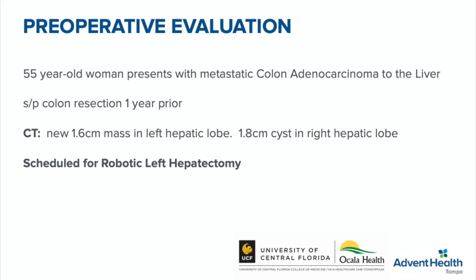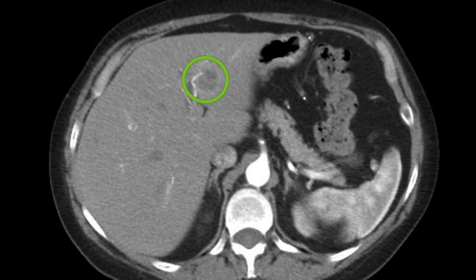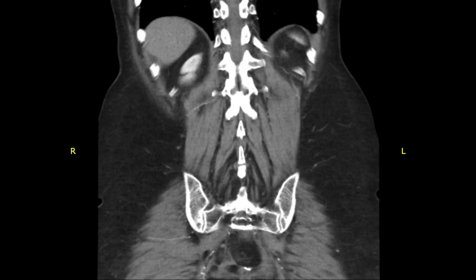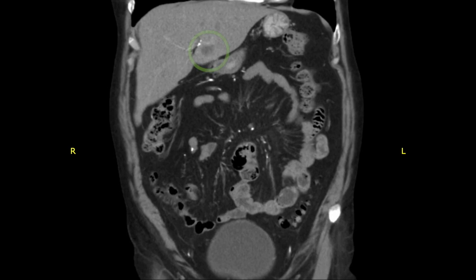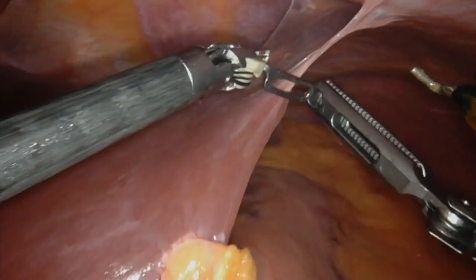A CT scan showed a 1.6 centimeter mass in the left hepatic lobe and a 1.8 centimeter cyst in the right side. The CT scan showed a lesion in segment 3 of the liver, very close to the base of the umbilical vein. The coronal imaging confirmed the presence of the lesion in segment 3 of the liver, as shown on the screen.